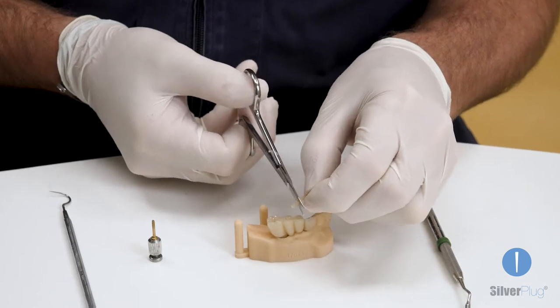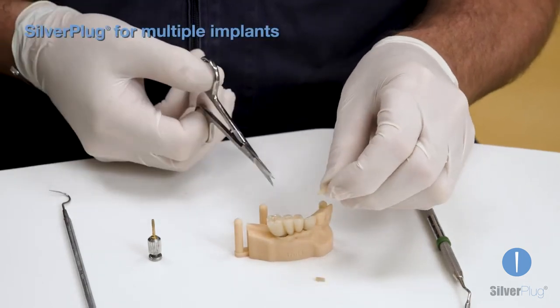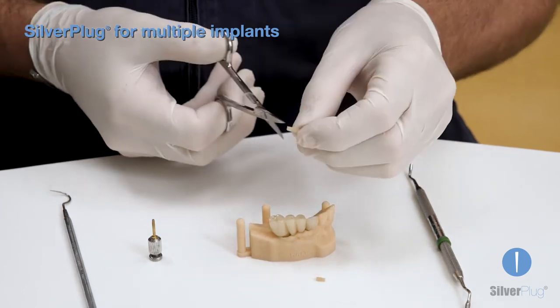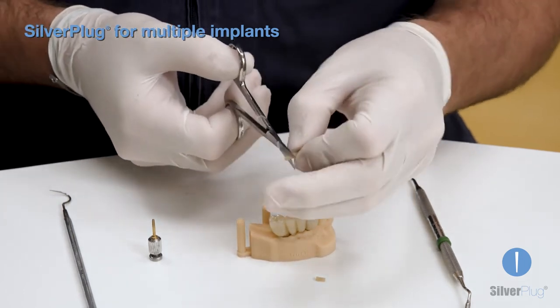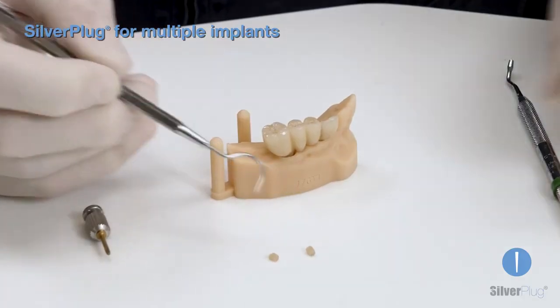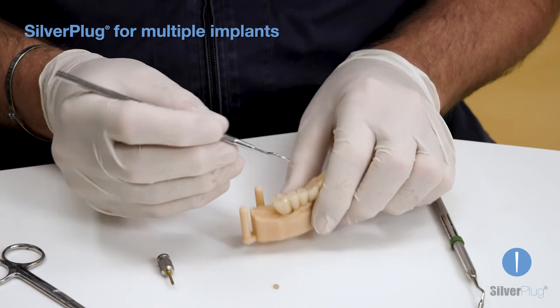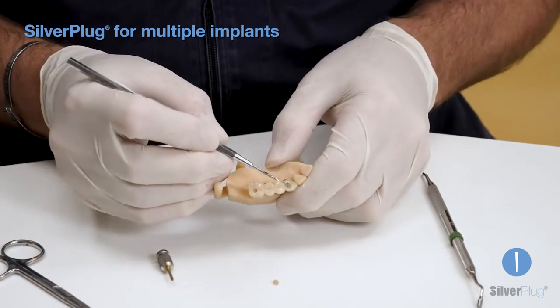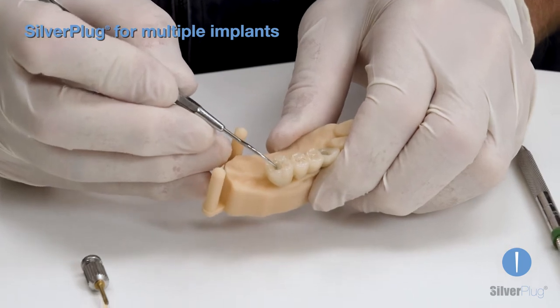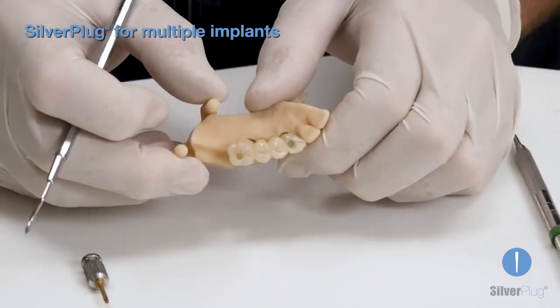In the case of a bridge with several elements, it is possible to use only one SilverPlug, obtaining several sections. In this example of a 2-piece bridge, it is sufficient to remove the thinnest part and obtain the 2 sections that correctly fit to the diameter of the tunnels. This is the result.